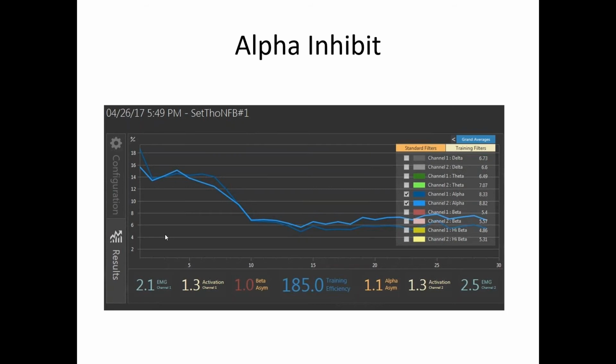And that might be confusing to people as well. Well, that's a good point. That is a caveat, and that's a player who's not working with the team. Yeah. Right? They all should be working together, and that is confusing.